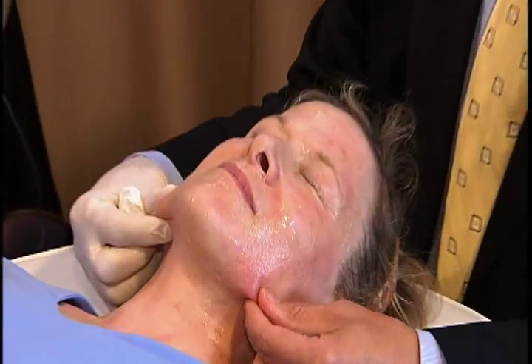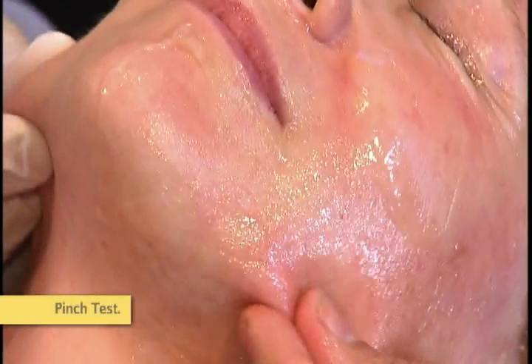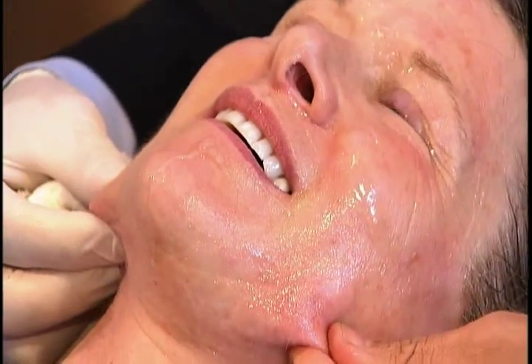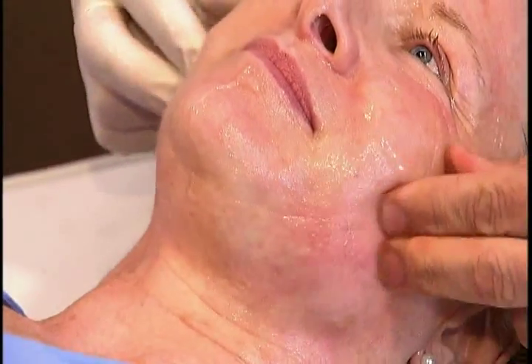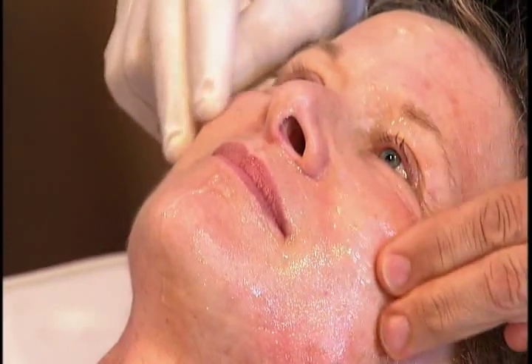And granted, it's slippery over here, but tell them what you can feel in the texture of your face. Again, I can feel it from here. I feel like I'm missing some skin over there. Yeah, it's just a great initial response. So this is that pinch test, and the patients really do get excited about it. It lets you assess what you're getting to.